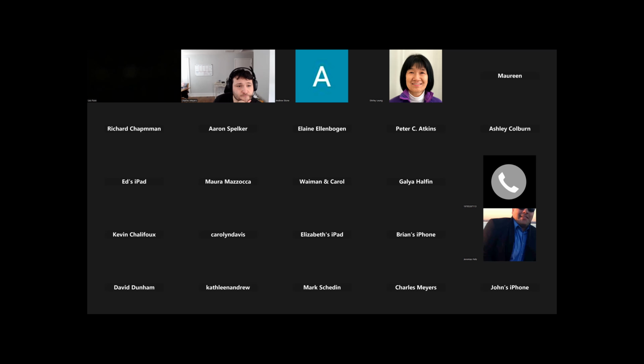Going back to the assistive hearing device for Richard and anyone else, you can always check with the Mass Commission on the Deaf and Hard of Hearing if they have it. Massachusetts, at one point, had a program where you could get an assisted listening device for a Board of Selectmen meeting or a town meeting or a city council meeting, and wear it so you could hear whoever has the microphone. You can ask if your city or town has a disability commission, or the city council or board of selectmen, if they could get one so they will have it at these meetings.